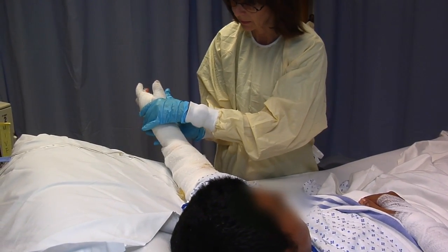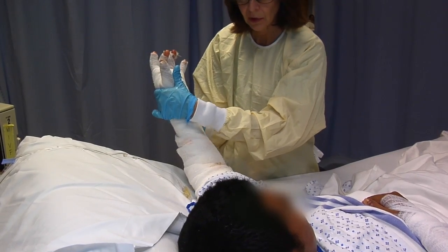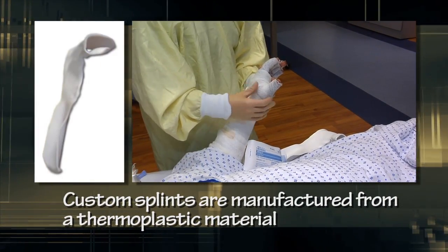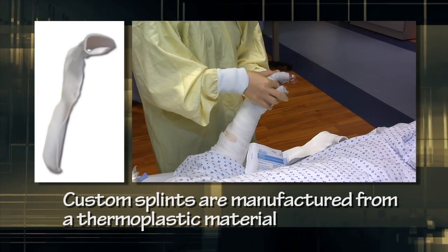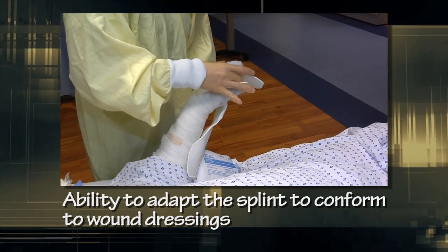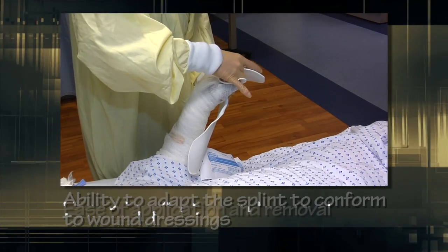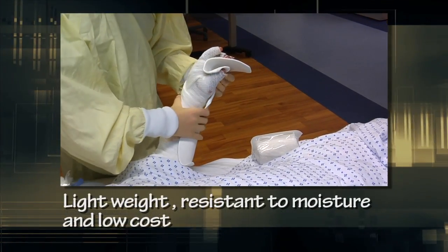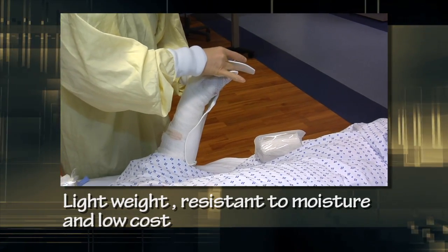Splinting modalities used depend on the phase of wound healing. Custom splints are manufactured most frequently from a thermoplastic material. The advantages of this material include the ability to adapt the splint to conform to wound dressings, ease of application and removal for dressing changes, light weight, resistance to moisture, and relatively low cost.